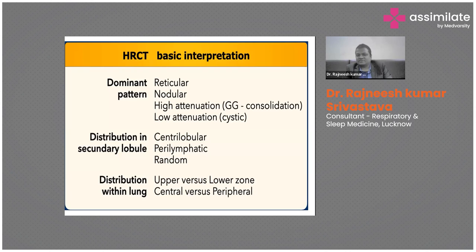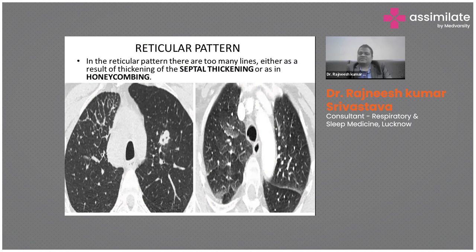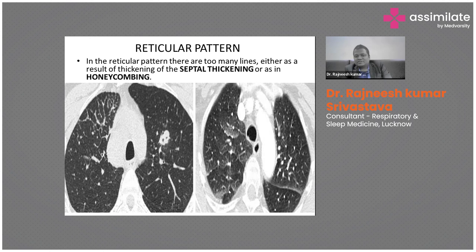The reticular pattern is the predominant pattern in interstitial lung diseases. Reticulation occurs when there are too many lines, either due to septal thickening or honeycombing. On CT scan there are multiple visible lines forming this reticular pattern. In another X-ray, reticular patterns were present alongside a mass — that patient was diagnosed with lymphangitis carcinomatosa, where malignancy spread through lymphatics caused the reticular pattern. Another patient had cardiogenic pulmonary edema producing a similar reticular appearance. CT alone does not clinch the diagnosis.